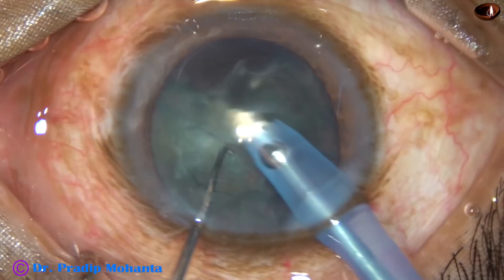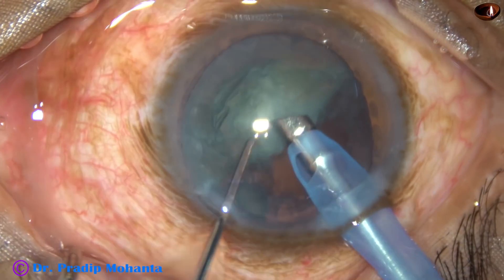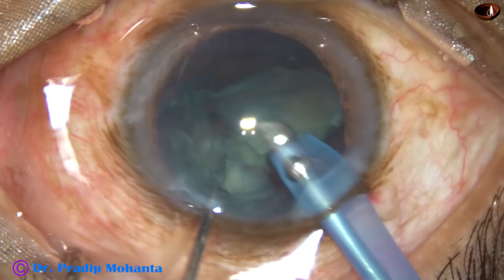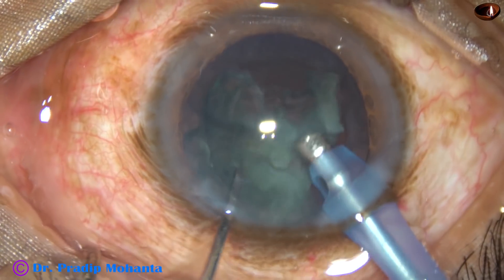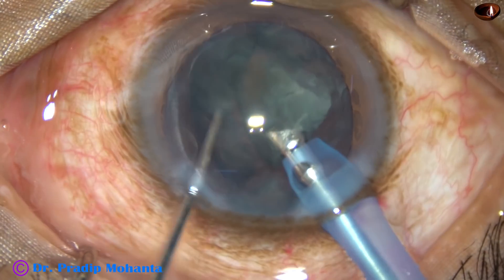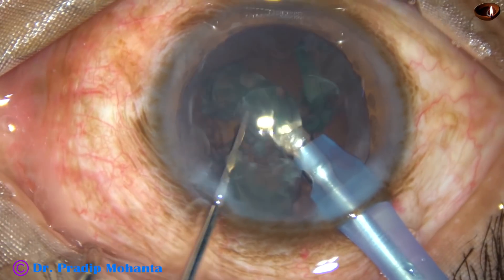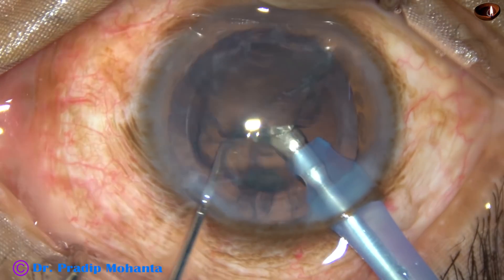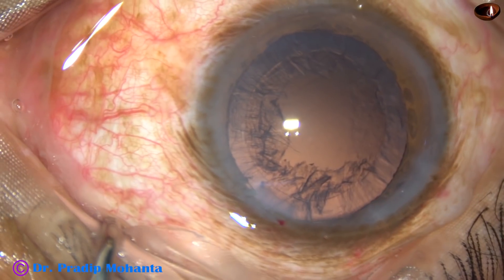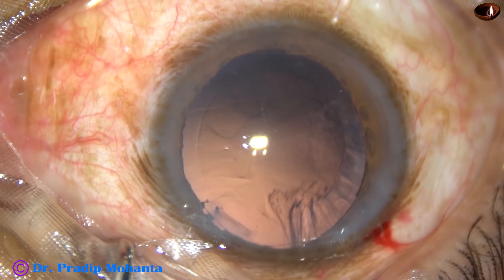The tip is managed in such a way that followability increases, and the hemi-nucleus is conquered. The other hemi-nucleus is also removed in no time. Why should we try different techniques? Because if we increase our experiences, our confidence level increases, and we become a better surgeon day by day.